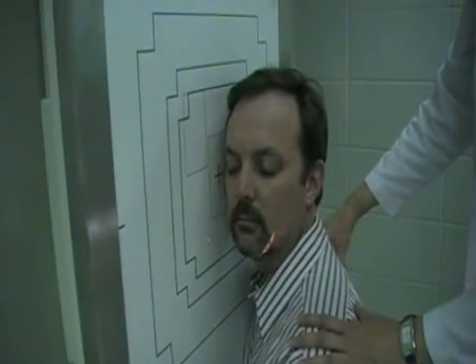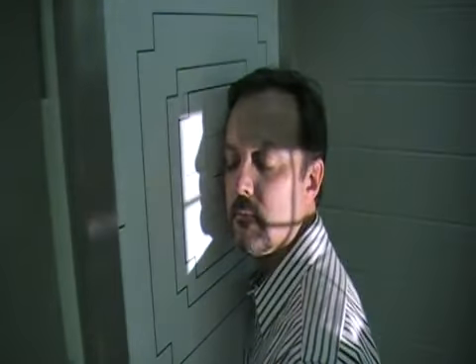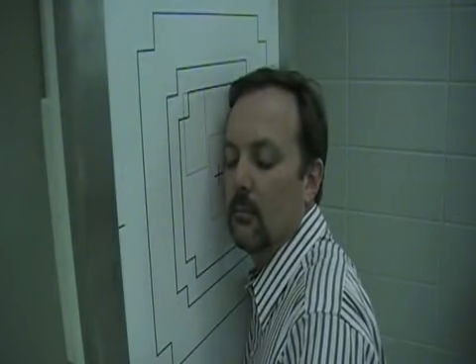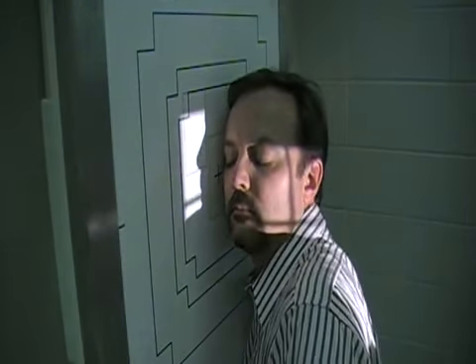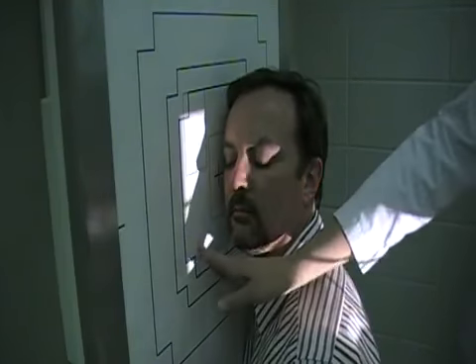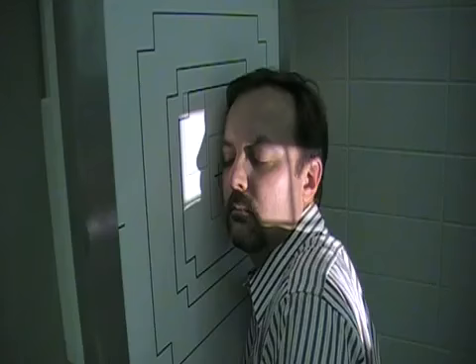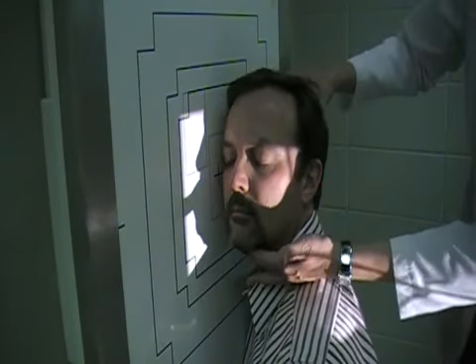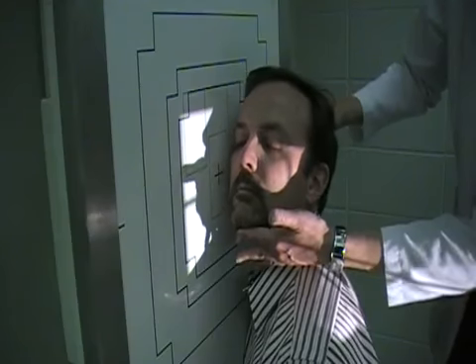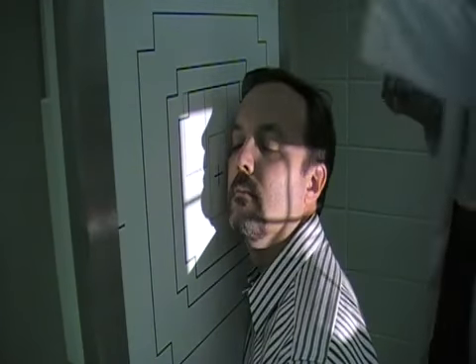You're going to have the patient relax their shoulders down, because it is so easy to get an image of the shadow of the shoulder in the mandible. So you can see, looking at the shadow, how a shoulder shadow would affect your mandible picture. So make sure that it is relaxed down, and then you can have them extend the chin up in the air just to make sure that you do clear that area.